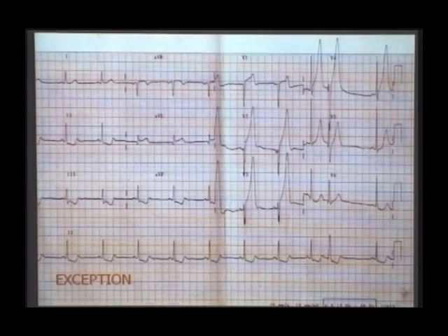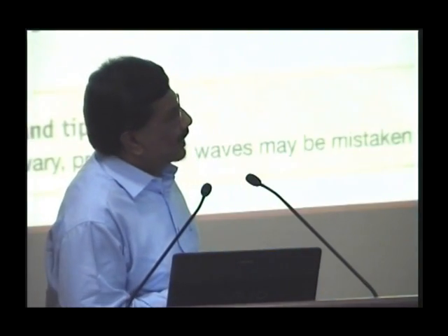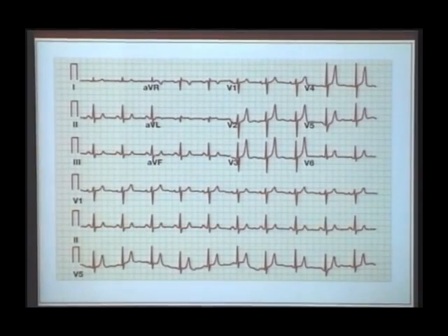Compare with the previous ECG here. See the base, see the apex; see the base here, see the apex. So nicely you can see, once you look at this T wave, you know it is hyperkalemia. So look at the contour. Whenever there is a tall T wave, broad base and blunt apex is ischemia, narrow base and sharp apex is hyperkalemia. Two conditions which can produce tall T waves. Whereas the low voltage T wave will be less than 20% of the preceding R wave.